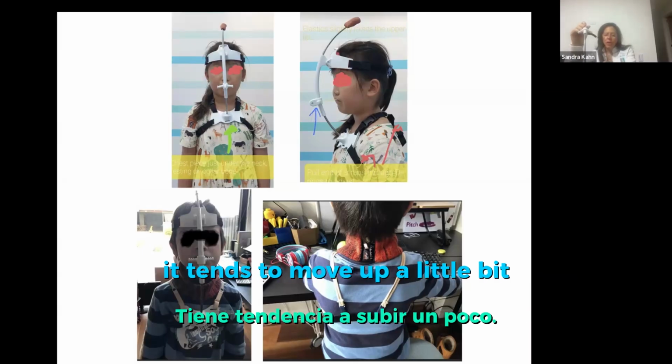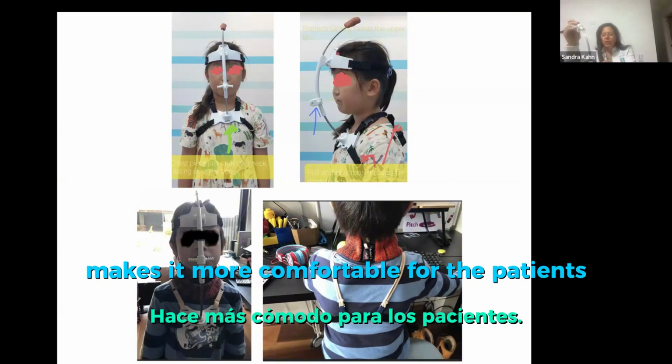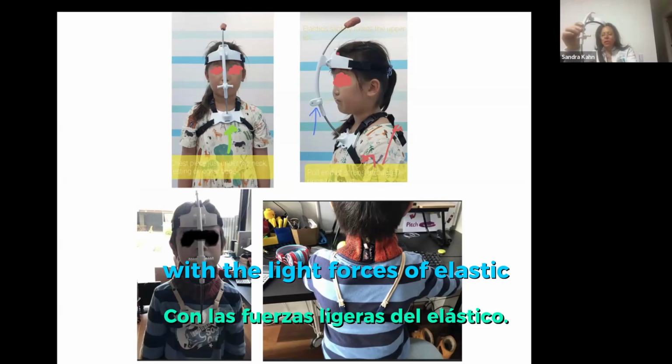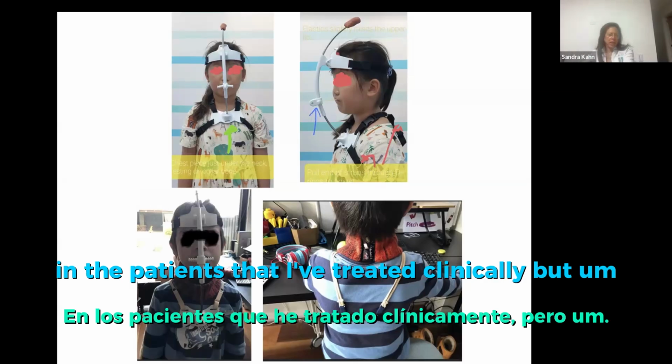So keeping it down makes it more comfortable for the patients. I feel that this device doesn't need to be tight. It can actually be pretty free with the light forces of the elastic. So I don't find that straps are necessary in the patients that I've treated clinically.